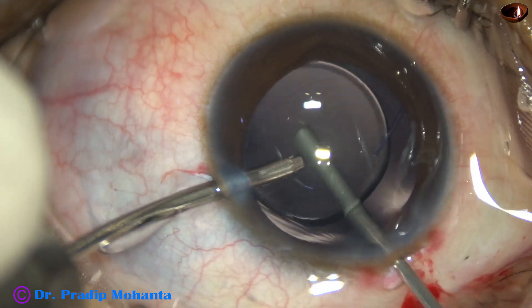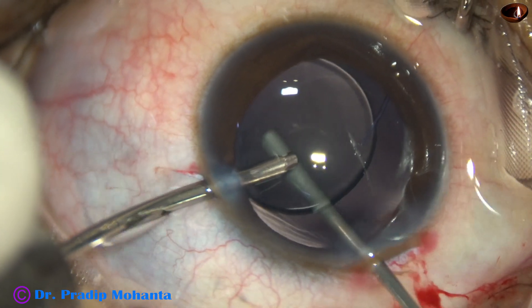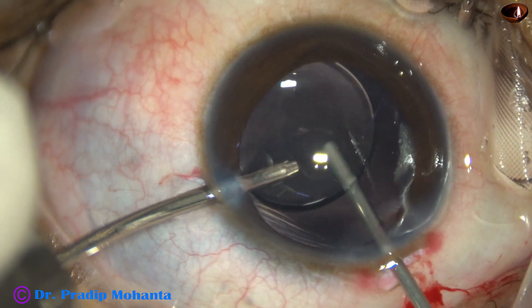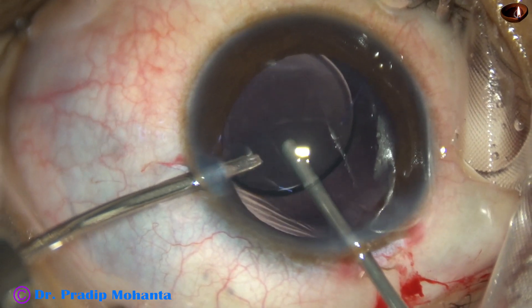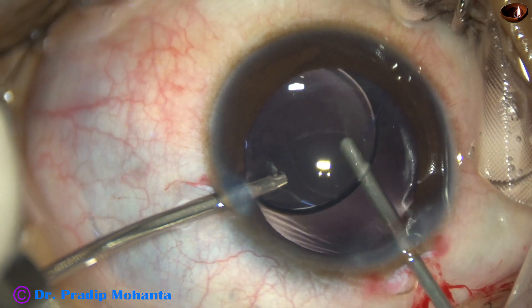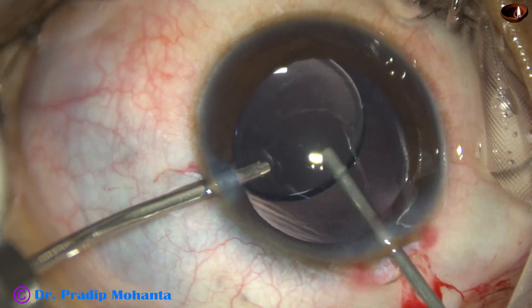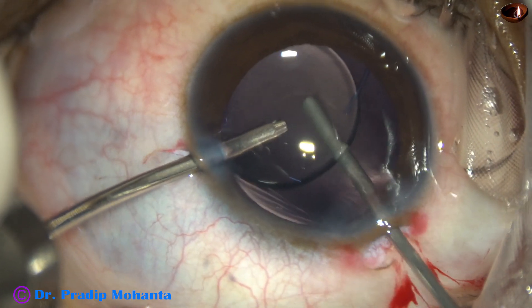At this time, I am cutting the posterior capsule with the vitrectomy cutter, enlarging the wound as much as required, and removing some vitreous from the anterior aspect of the vitreous cavity. This vitrectorexis doesn't suddenly extend to one side — we can enlarge as much as we want, and the vitreous doesn't come to the wound.